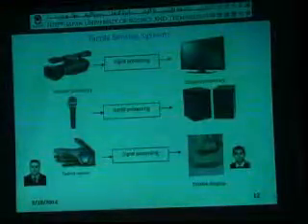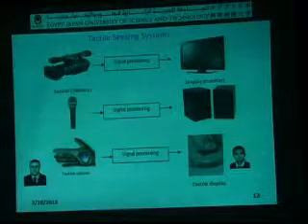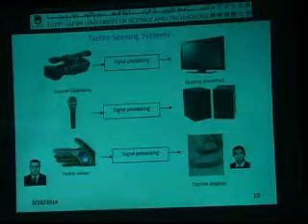Second thing, the tactile sensing system. Tactile sensing system may be strange to us. Tactile sensing system is like a vision system. In a vision system, you have a sensor, which is a camera, and you have a display, which is a monitor. And in a sound system, you have a mic, and you have a display like a speaker. In tactile sensing system, you have a sensor, a tactile sensor, and a tactile display unit. So by this system, you can transfer the touch inside the abdominal wall to the surgeon. What is done in here, the soft tissue of the patient, you can consider it like a spring.